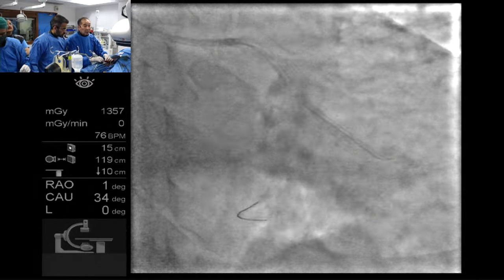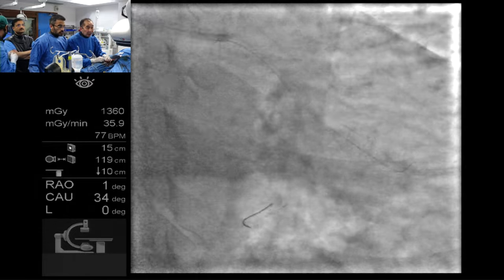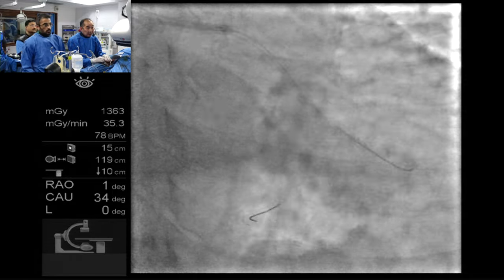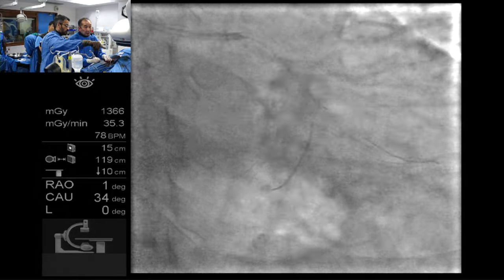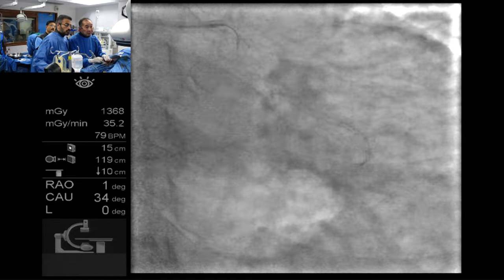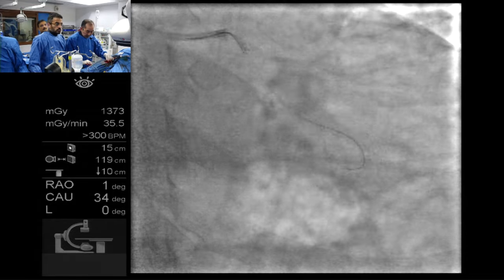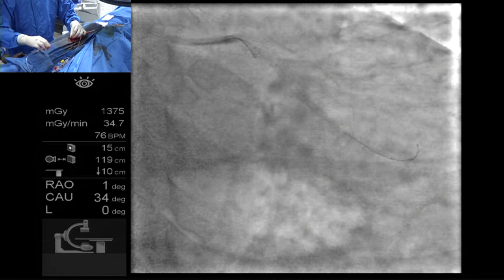Now, this one. Okay, I think if we can get a micro catheter change into some other wire, a wiggle wire or something like that. Yeah, Tak, I was going to suggest maybe a Corsair. Okay, yeah, extension. I think if you want to try advancing the balloon now, it might go because you just changed your geometry completely.